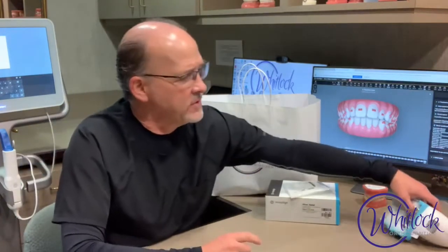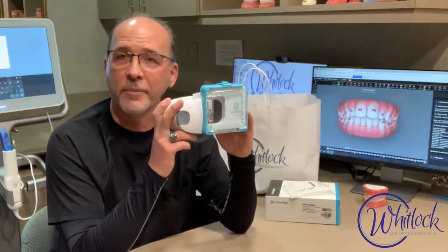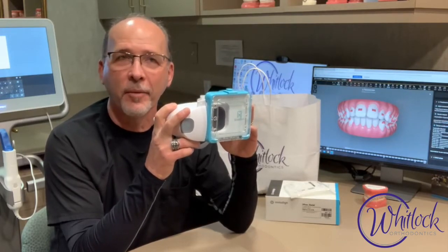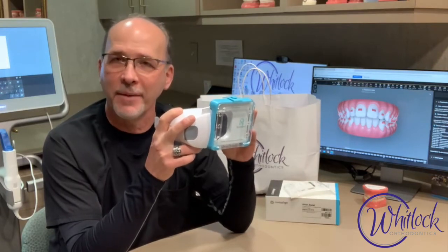The other thing in your kit I want to go over is your dental monitoring scan box and your scanning. This is really cool — this is what changes everything for us. We can provide such better care for you, and it takes a lot less time and visits for you.